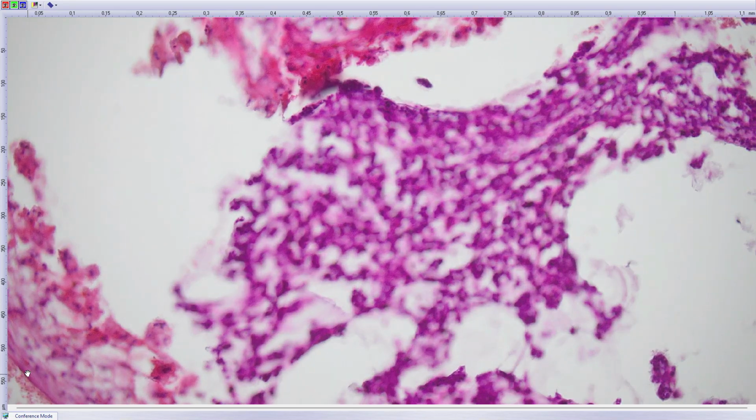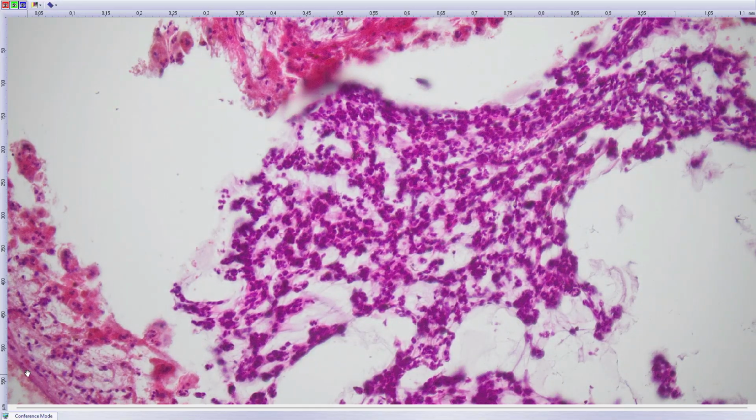And the tumor came back, and it's quite a big mass on the shoulder. It's female, no, it's a male patient, 43 years old.